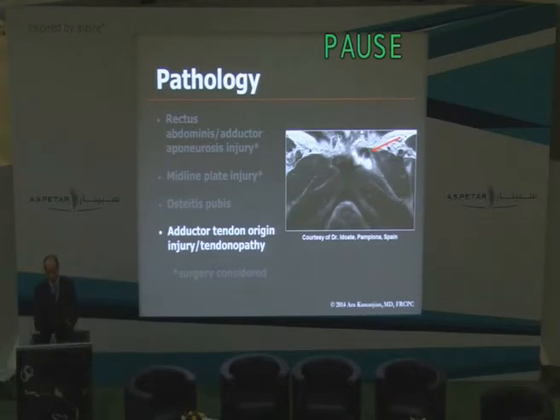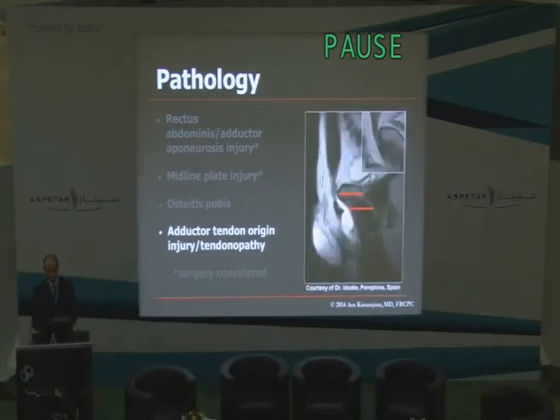And then we see the adductor tears, and these are not hard to see. The tendon is completely separated from the entire perisymphyseal complex, and you can see a fluid-filled gap on this axial T2 weighted image, and this is the fluid-filled gap. I think what we need to really look at closely in these cases is go back and look at the sagittal images to decide whether this is strictly a tendon abnormality or is this now actually involving that entire complex, that midline plate, that aponeurosis and extending up and involving part of the lower rectus abdominis muscles and its sheath and the joint capsule. Those may be two different entities. I think it's a continuum, but they may have consequences regarding treatment.